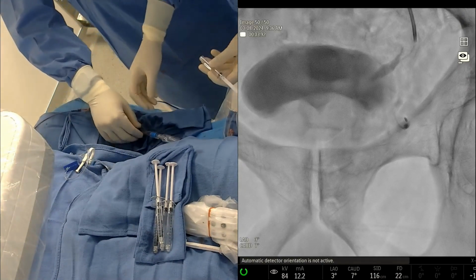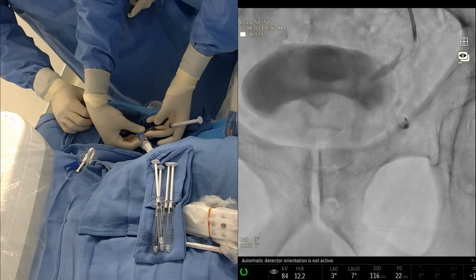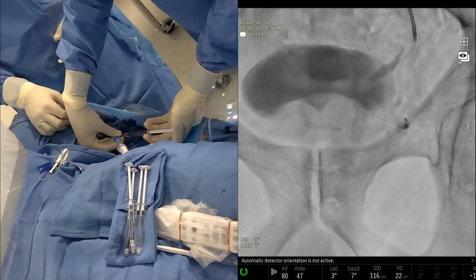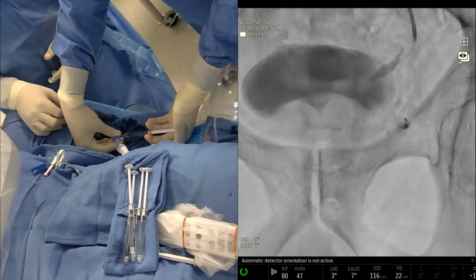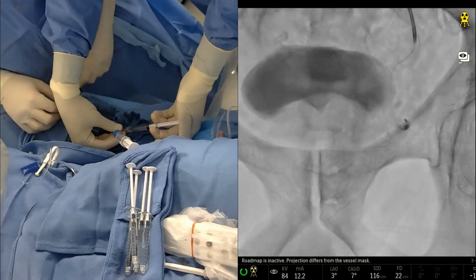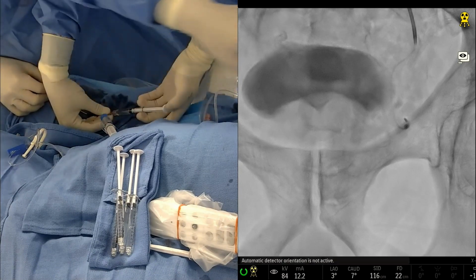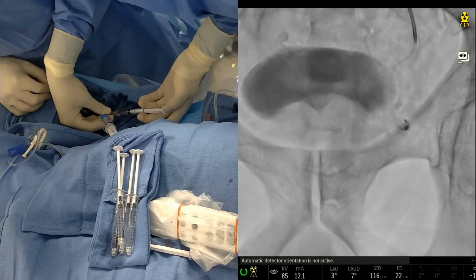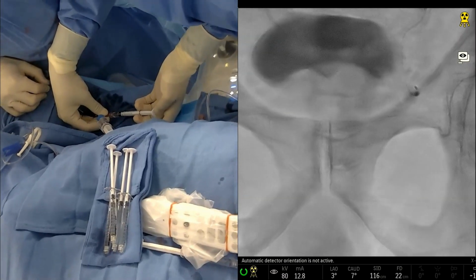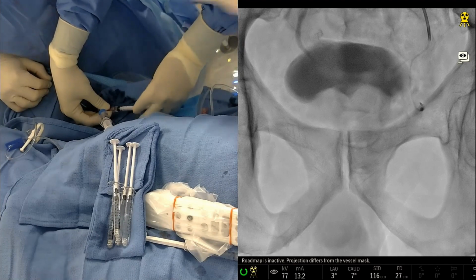This is D5. All right, so Puneet's going to flush the catheter with D5, 3 cc's. And I know we're going pretty fast here. We're going to have lots of time for discussion as we go to the other side, but we wanted to start and show you guys how we do this on one side, and then we can keep talking. This is really the only part of the procedure that I think is a little bit nerve-wracking because you never know completely where the glue is going to go. But we've done this a lot, and so slightly bigger view there. We feel pretty good about this location.